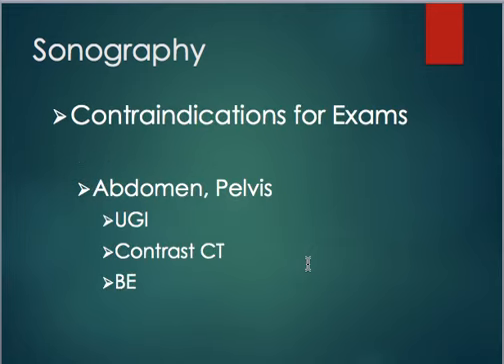Contraindications, or things that would interfere with an ultrasound exam. If you're having an abdomen or pelvic exam, you cannot have an ultrasound done after the patient has had an upper GI, a contrast CT, or a BE scan. Do you guys remember why?